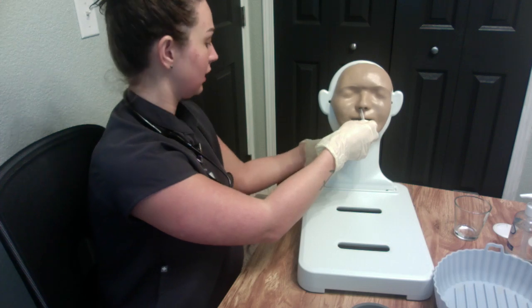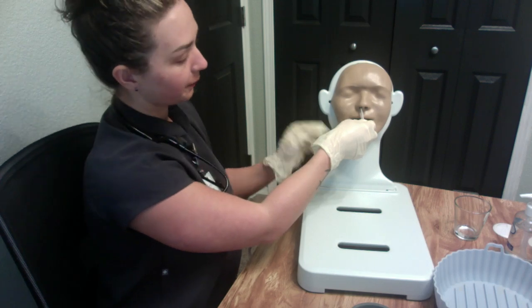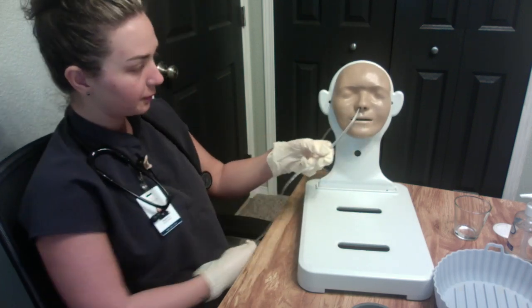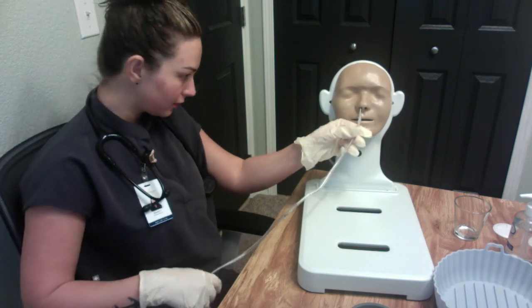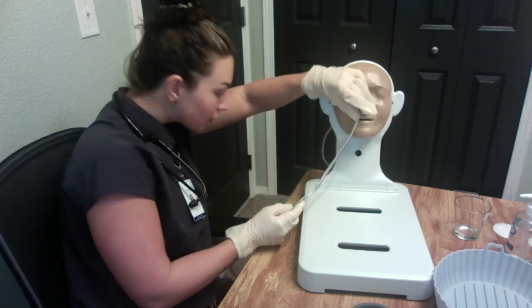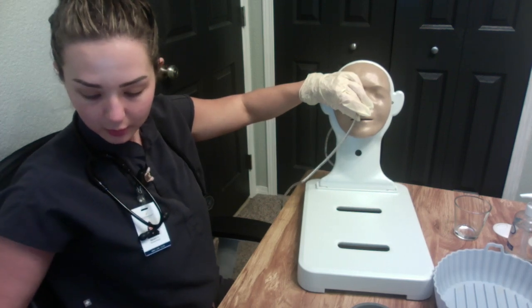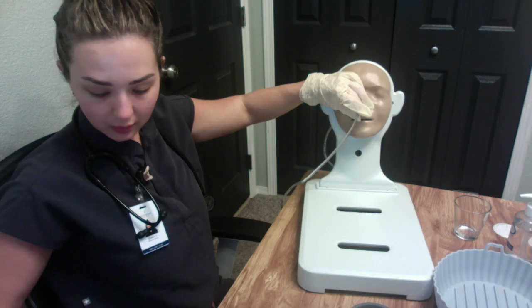Are you doing okay? Yes. Okay. So then from here, we would go ahead and secure the tube.